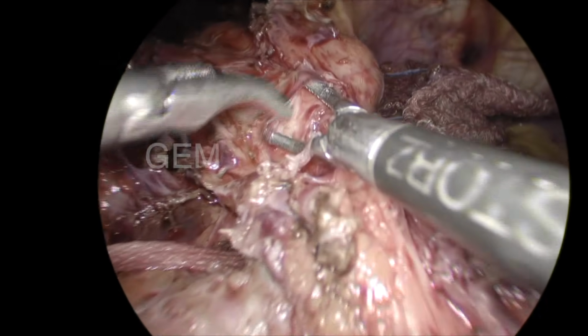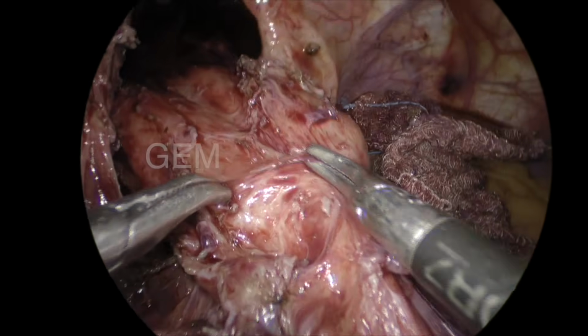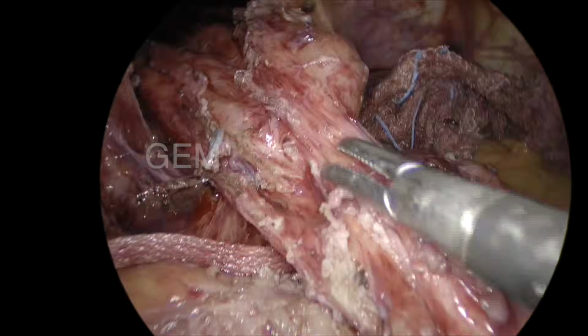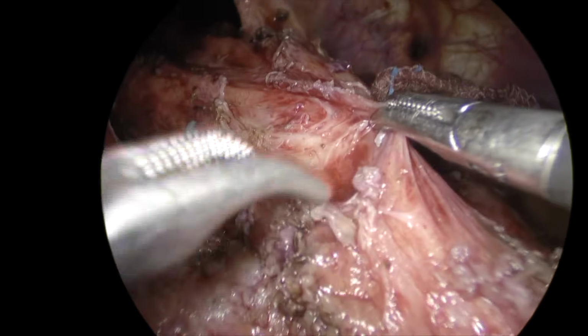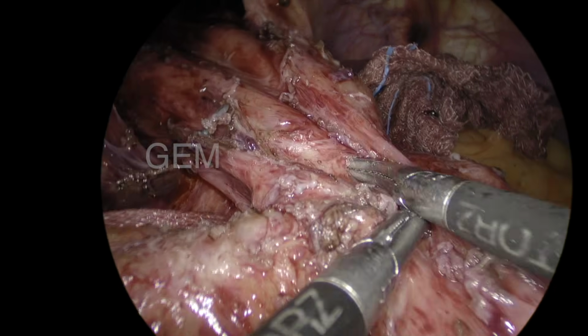In all other videos, if you see, I start the myotomy from the esophagus, OG junction, and then stomach. Here it is stomach, then OG junction. Now you can see, the mucosa is already very clearly seen on the esophagus side. Only at the lower esophagus and the OG junction, some fiber is there. Up to that level, see, that is the divided edge. The blue color is the esophageal mucosa, and the pink color is the undivided muscle.